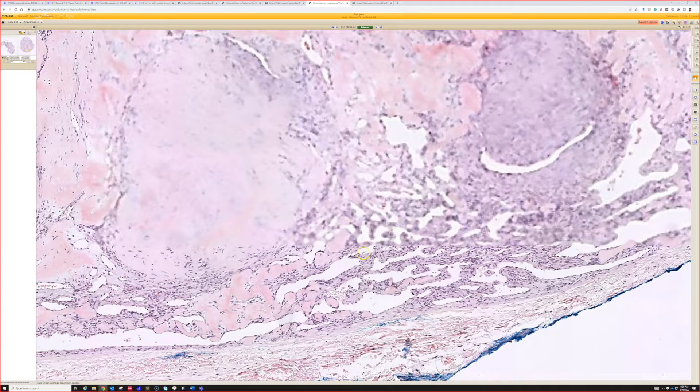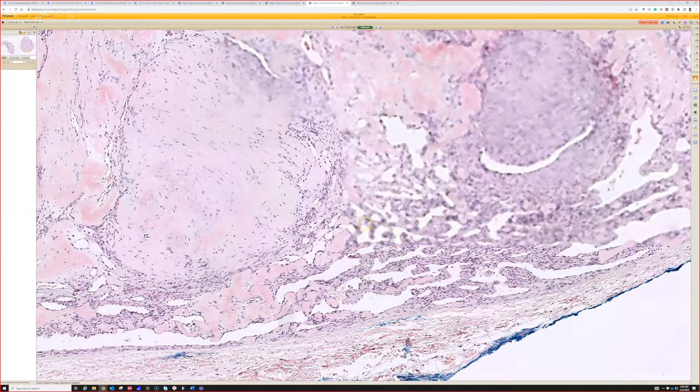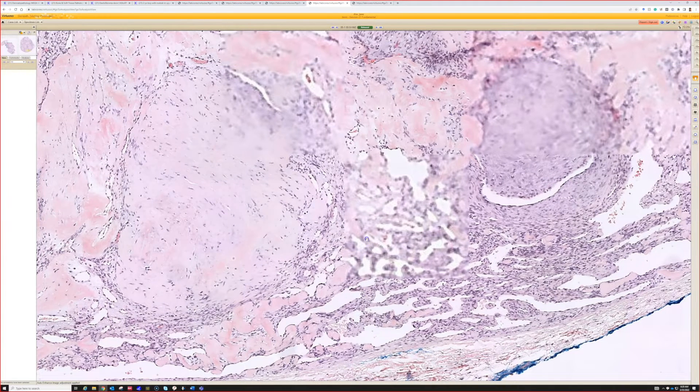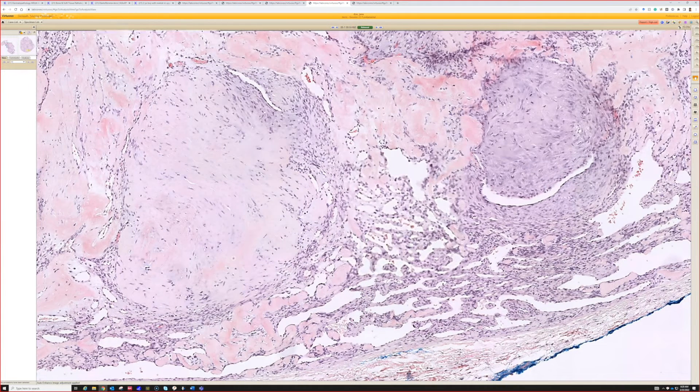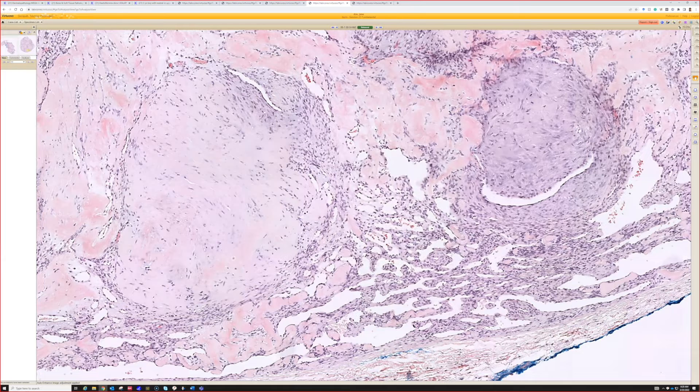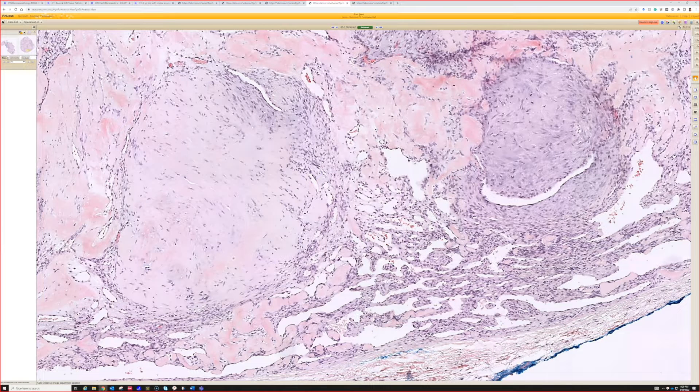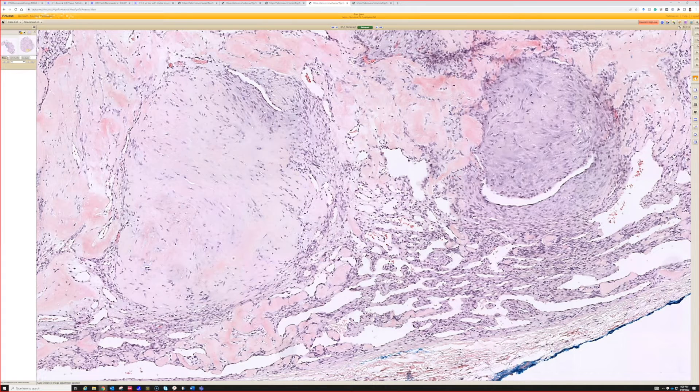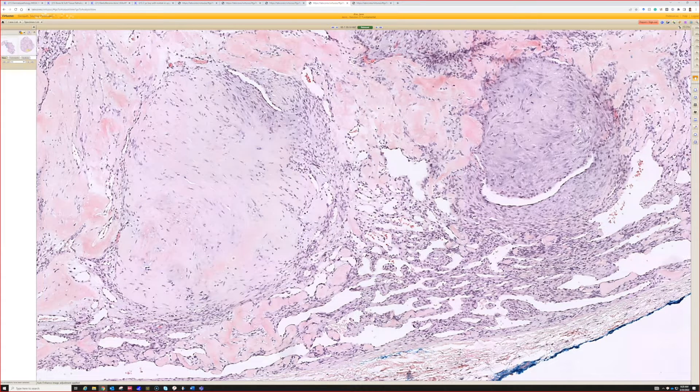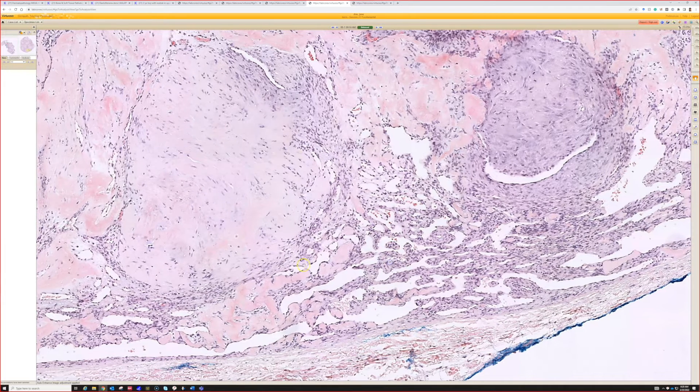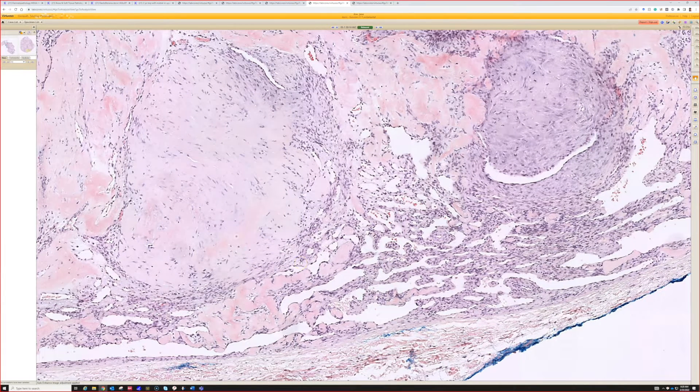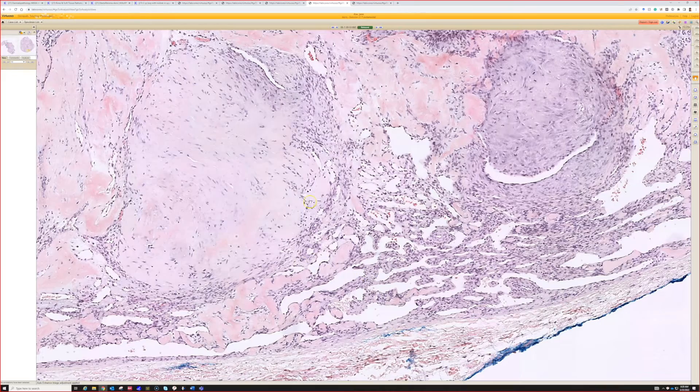Tell me about the two populations we're looking at here. I think we're seeing fibroblasts, and then kind of like these plump fascicles.